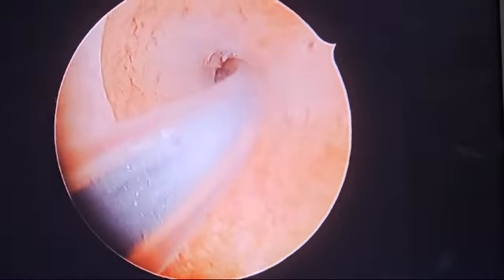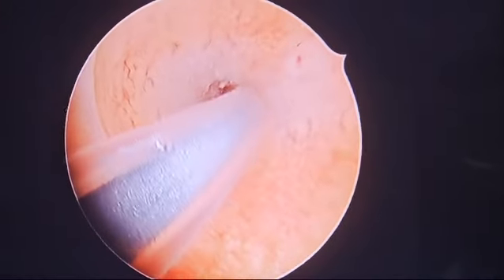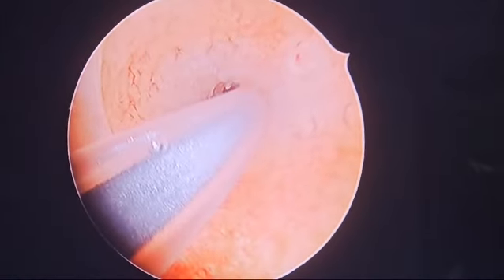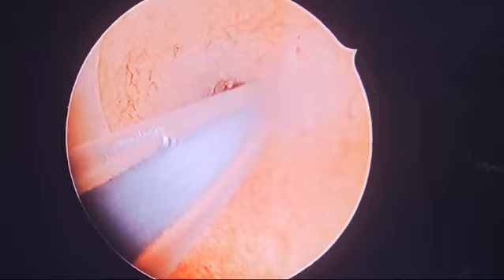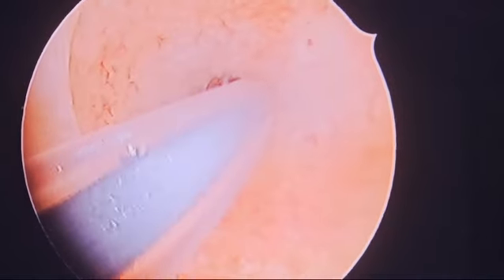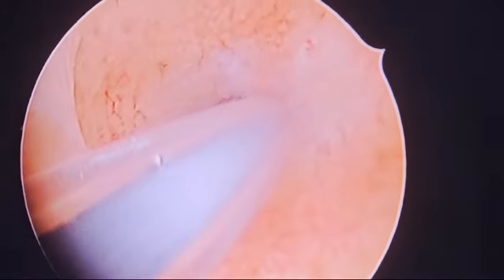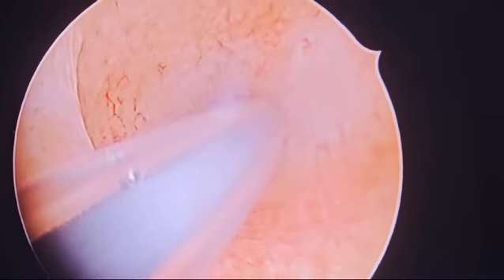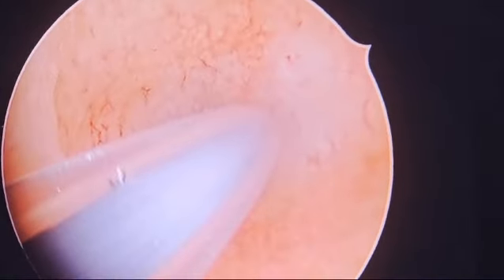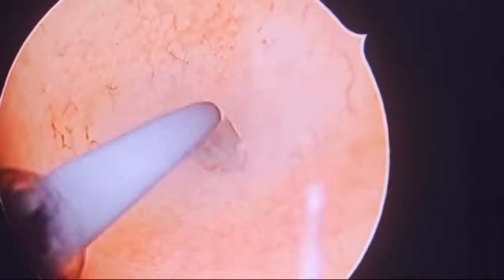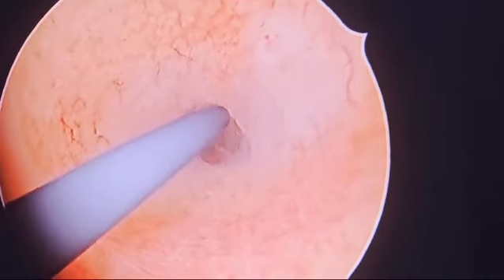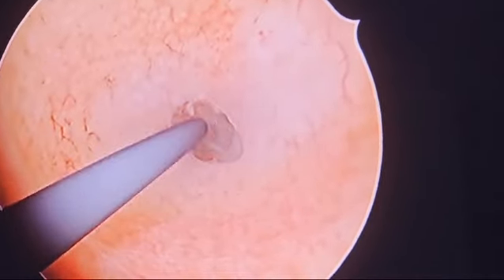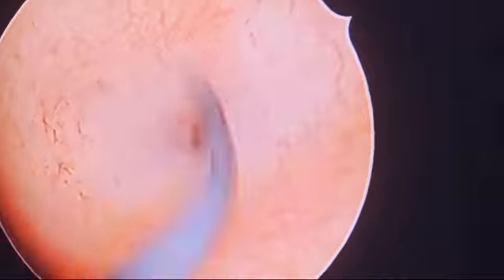Today we are describing tubal cannulation for blocked fallopian tubes. This is the right uterus — we have done the tubal cannulation. Mr. Neeraj will withdraw the guide wire. This much length of guide wire has been threaded in the left fallopian tube.